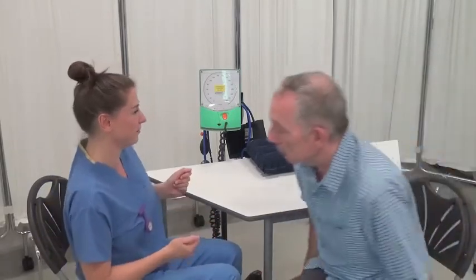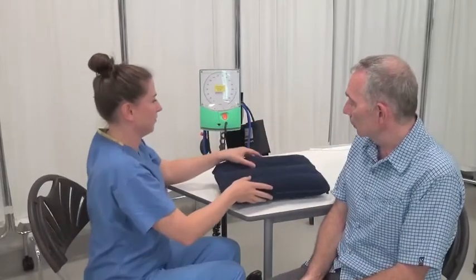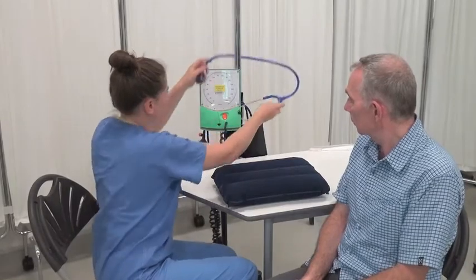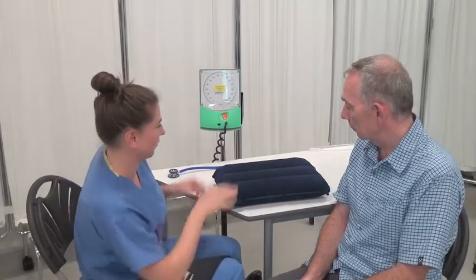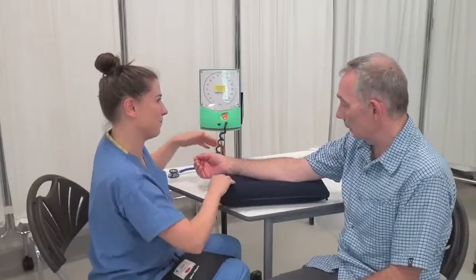I need to do your blood pressure reading now. Would that be okay? That's fine. Which arm would you prefer me to do the reading on? I've been using this one. Okay, so if you could just uncross your legs and sit up for me. Is that comfortable? That's fine, thank you. We'll use this pillow to make it comfier. And I'm just going to get my print ready. If you could pop your arm up there for me. Is that comfortable? That's good, thank you.